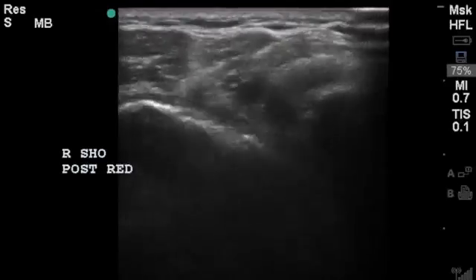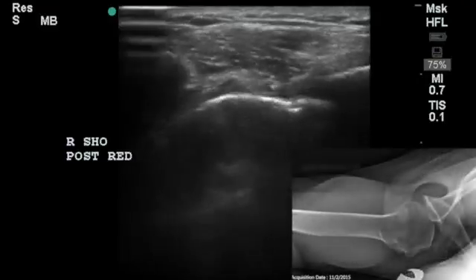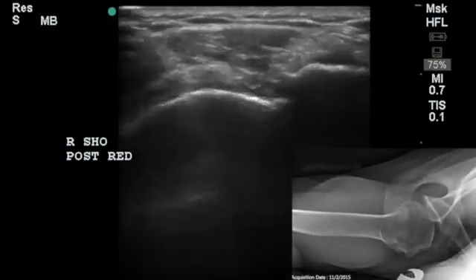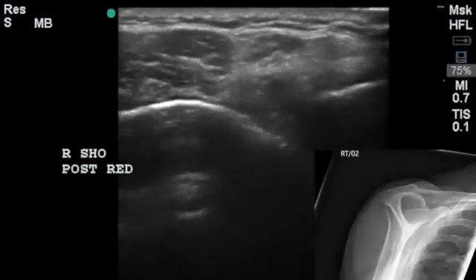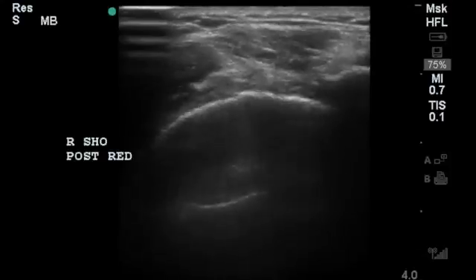The humeral head is now seated within the glenoid fossa, and you can see that it rotates in this clip as you externally rotate the adducted upper extremity. Success. For the more common anterior dislocation, you would see the humeral head displaced anteriorly relative to the edge of the glenoid.